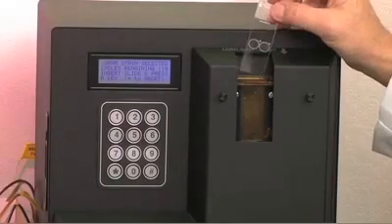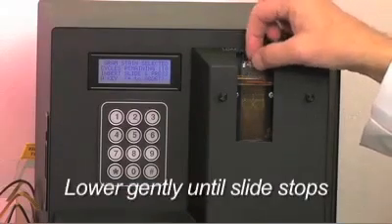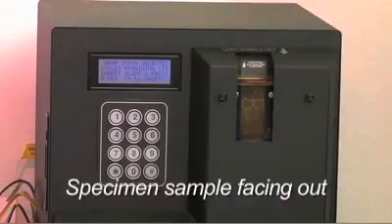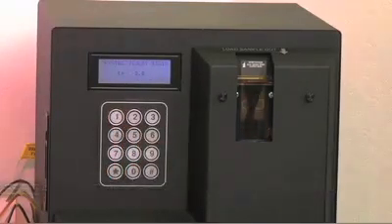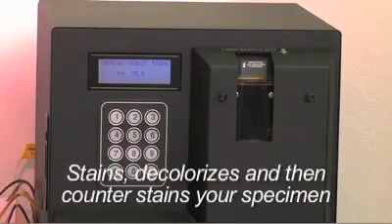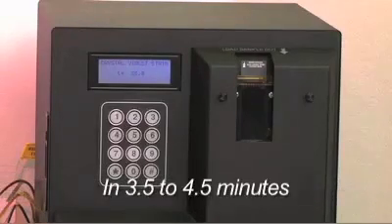Place a methanol-fixed sample slide into the cuvette, lowering gently until it stops, with the specimen sample facing out. Then press any key to start the stain process. The Gram Pro 1 stains, decolorizes, then counterstains your specimen in 3.5 to 4.5 minutes.